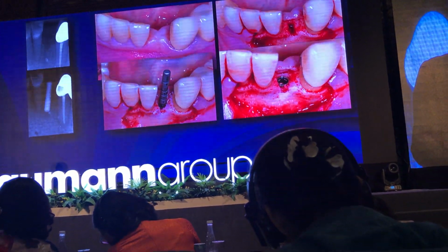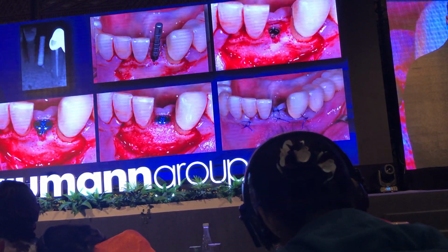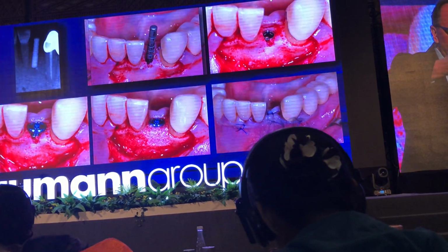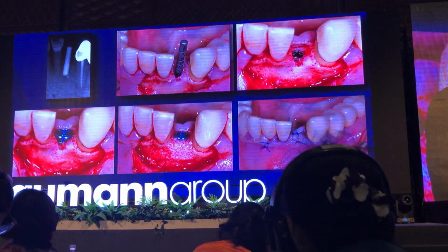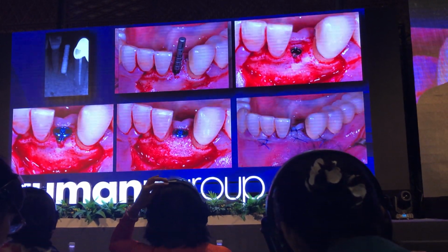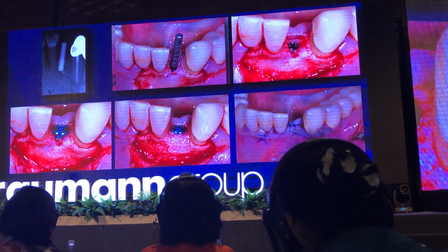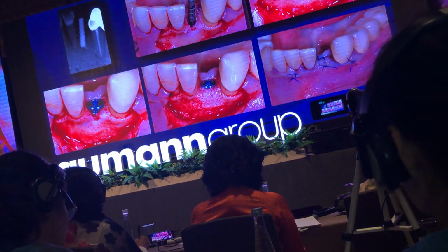Then we put a healing cap in. I have to say I don't like these healing caps. They are too bulky. I would love to have a slimmer one. So here you see that when they developed that implant, they did not consult with me, because that was done recently. And they have done these implants mainly based on feedback they got from the United States.